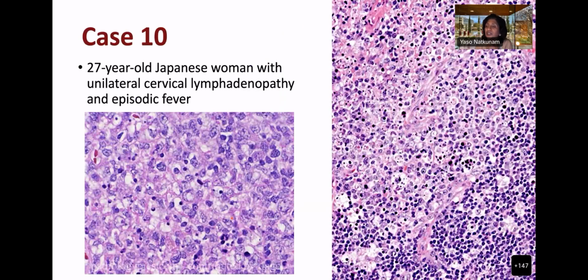Okay, anything else, or do we move to the last case? That's it. Yeah. Okay. All right. Again, my case examples are very typical because I'm trying to make a pattern point and not a diagnostic point, although it's related, of course. Anybody want to tell me what you're seeing?